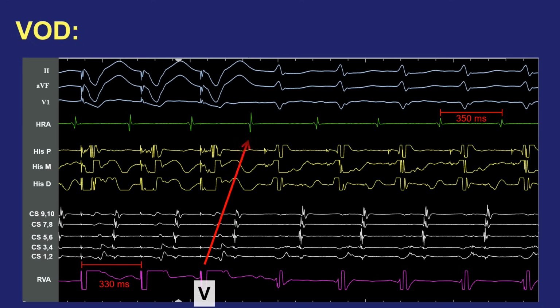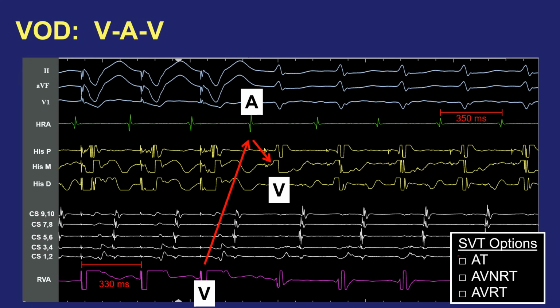We have a VA on that last paced beat. What's the next thing to happen? It's a V. So because we have a VAV response, we can now rule out atrial tachycardia and cross it off the list. Wonderful. One thing down.